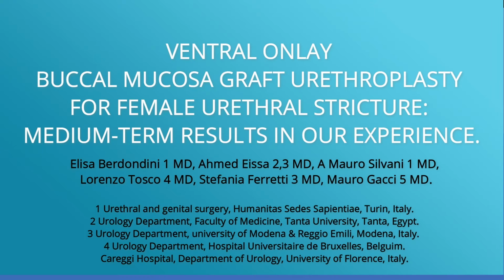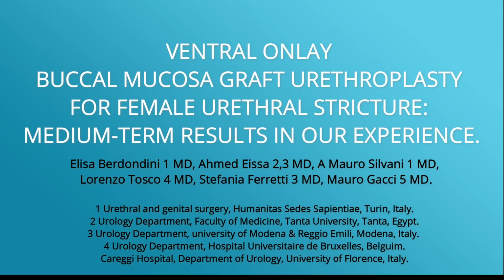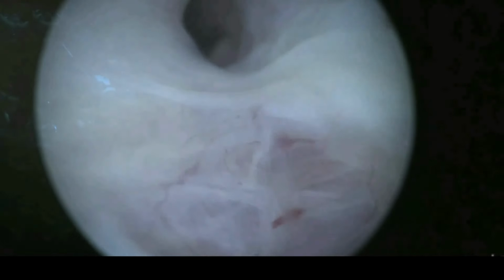Ventral onlay, buccal mucosa graft urethroplasty for female urethral stricture. Medium-term results in our experience. Urethroscopy to insert the guide wire in the tight urethra.